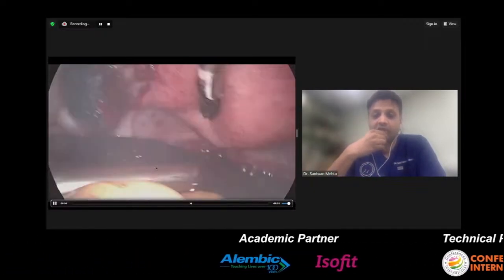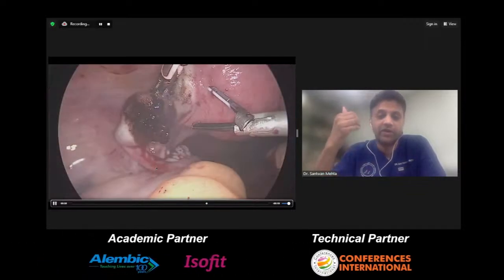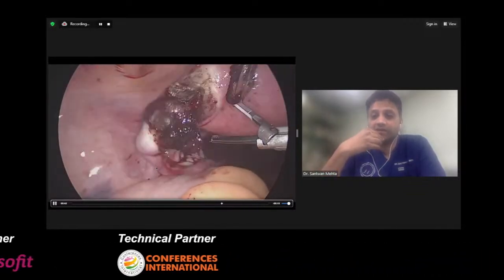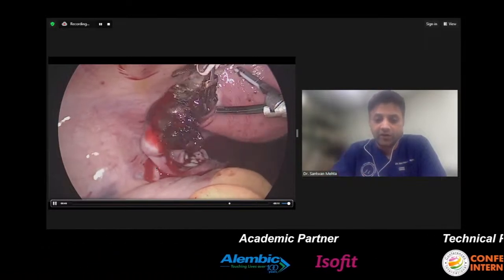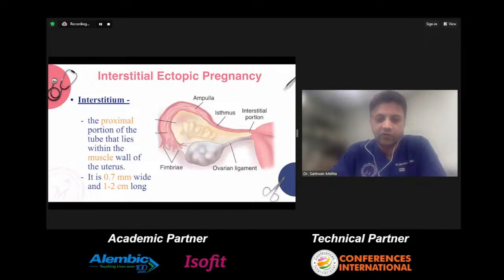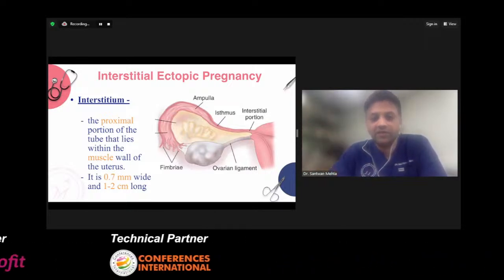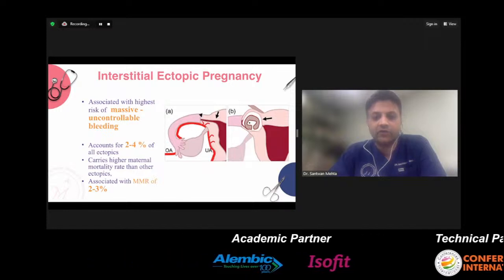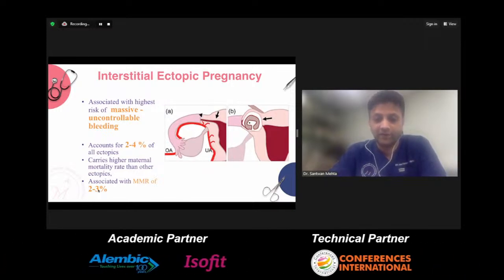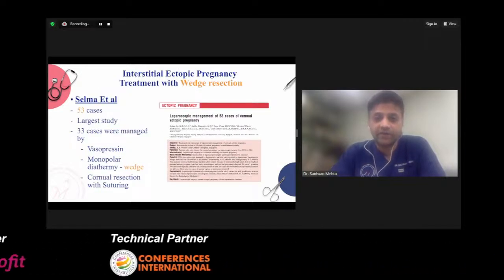In the past, many surgeons abandoned laparoscopy for such cases and went for laparotomy, and sometimes they had to resort to hysterectomy also, because these cases have a very high mortality rate. The interstitium is the proximal part of the tube which lies within the muscle wall, and because of its dual blood supply, the maternal mortality rate is as high as 2 to 3%. The usual way of dealing with such an ectopic pregnancy is a wedge resection.